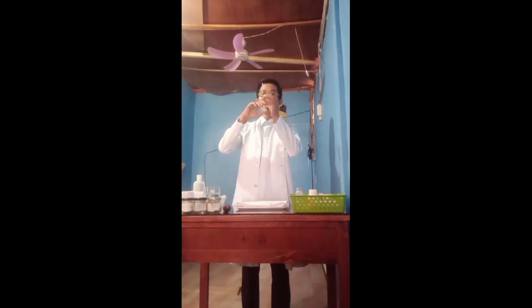The reason is to get medication to flow into the syringe and to prevent formation of bubbles that may lead to inaccuracy of dose. You also need to check the syringe for any bubbles.